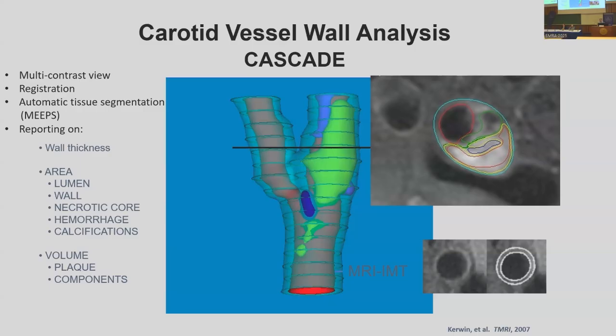And the other thing I think is interesting is all these measurements can be quantitative. Before that, the only measurement people had, in fact, was stenosis. So a real challenge from the point of imaging, of looking at stenosis, of looking at vessel wall, is all of a sudden you're dealing with a lot of different numbers. And we really have no clue which number is really important. For example, whether plaque burden and stenosis actually are the same thing.